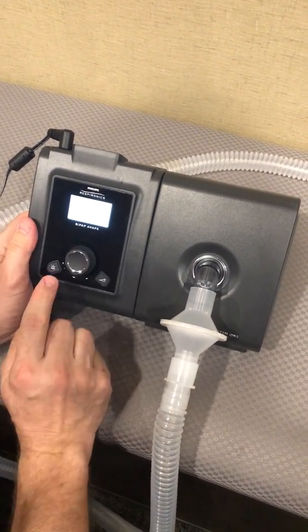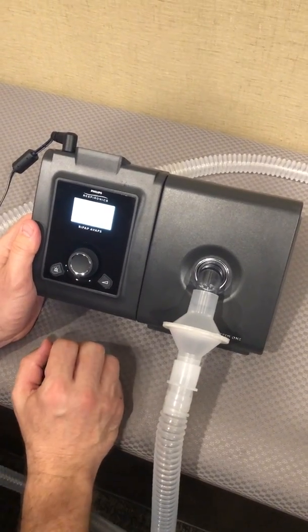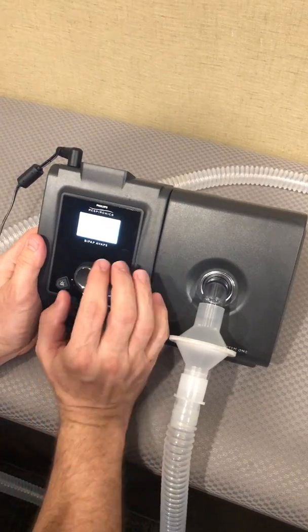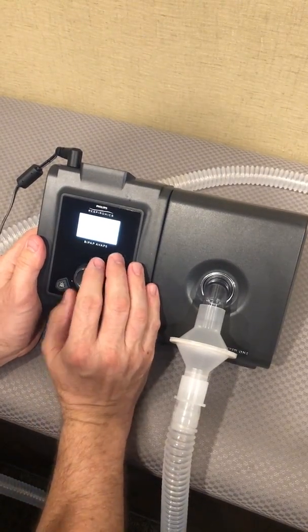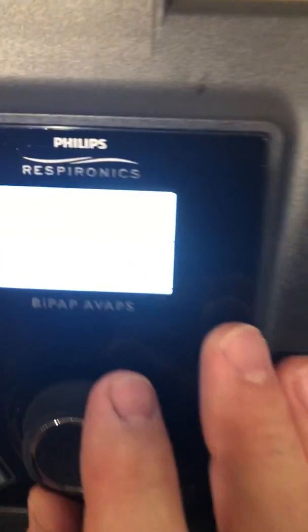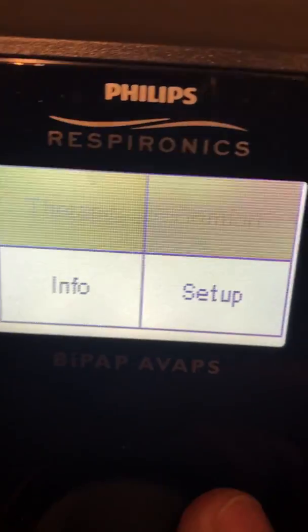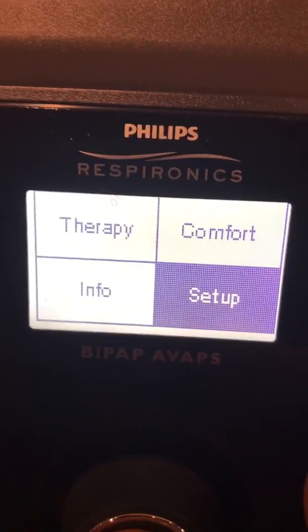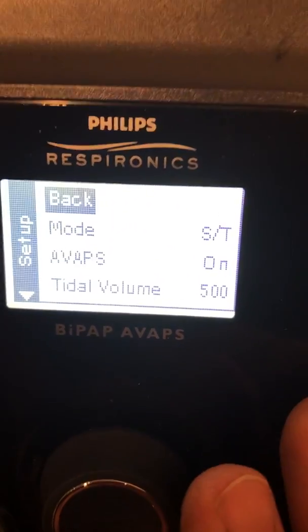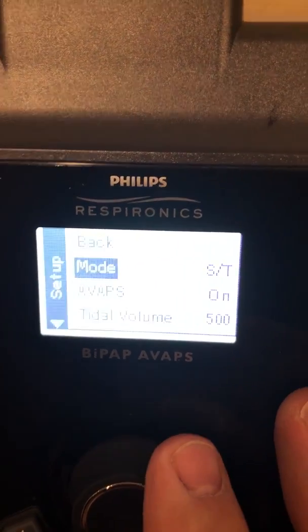The first things we're going to talk about are how to get into the menu and make some changes — just some very basic standard settings. Right here we're at our therapy choice on the menu. I'm going to push the main button and toggle over to setup. As you can see, we go to mode ST — that is what we want.